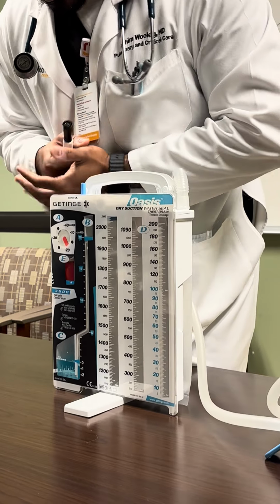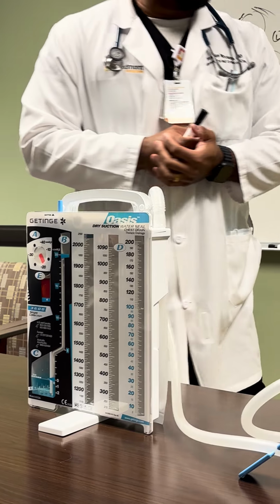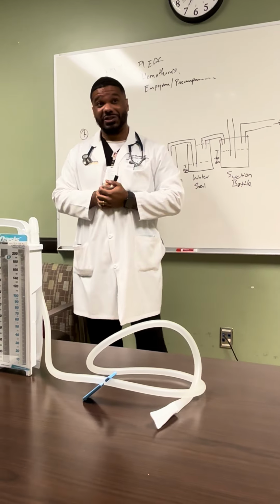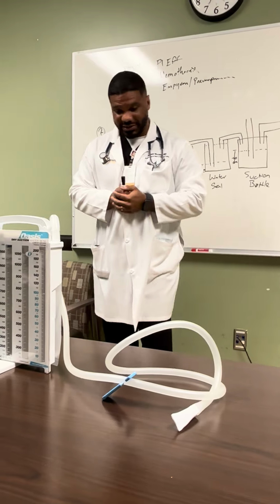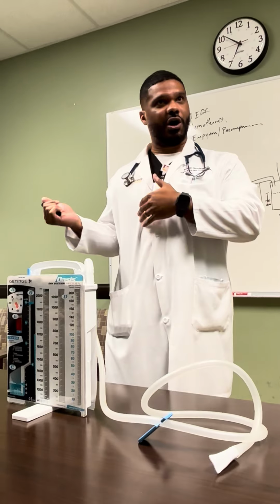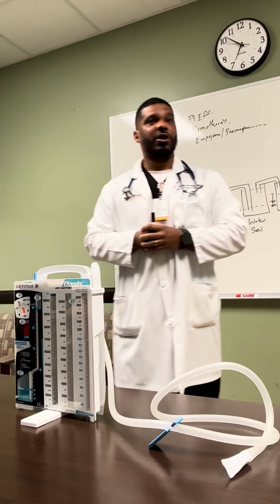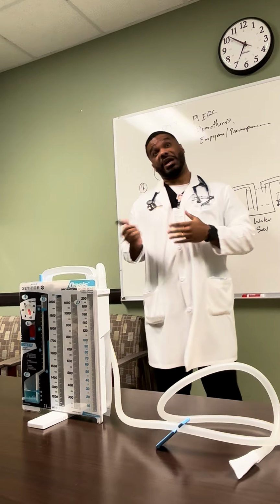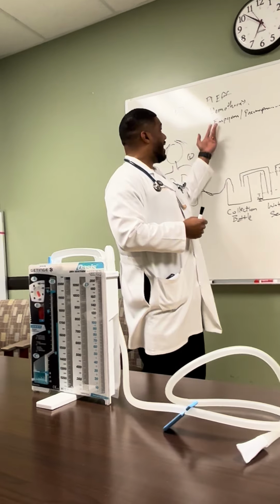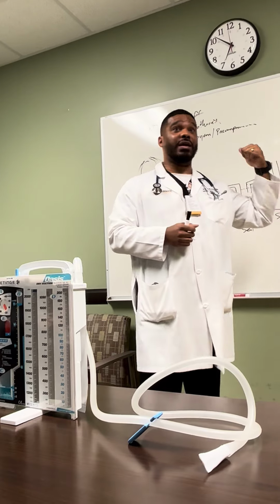We talked about air leaks. We talked about assessing the chest tube. One other question that always comes to mind is transporting patients. Transporting patients is usually a case-by-case thing. We usually get calls from staff in terms of, hey, does this patient need to go down on wall suction? Can this patient be disconnected? What I will tell you is that we need to go back and we need to be on the same page about why the chest tube is in place in the first place.